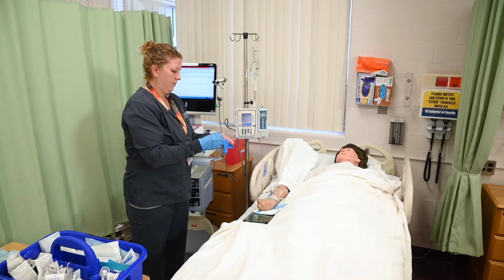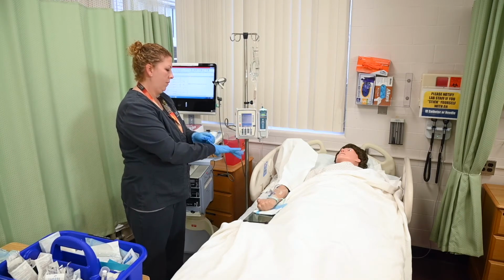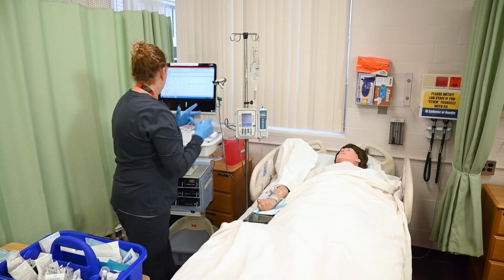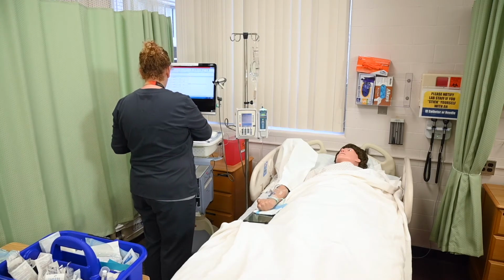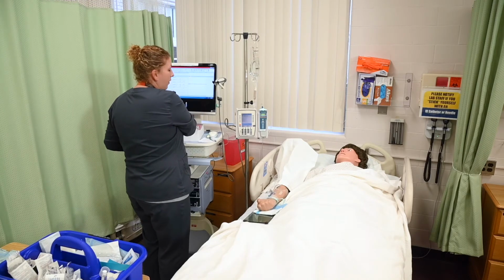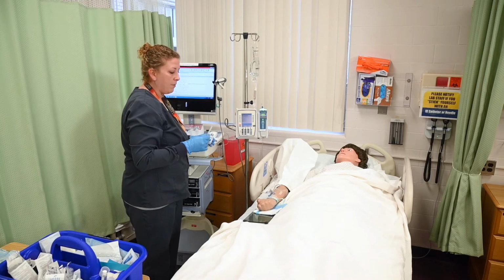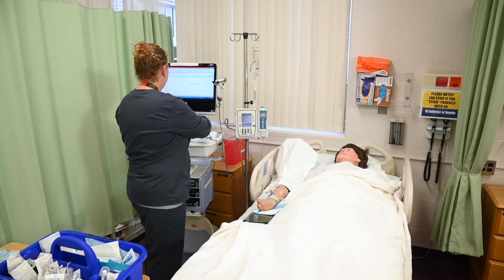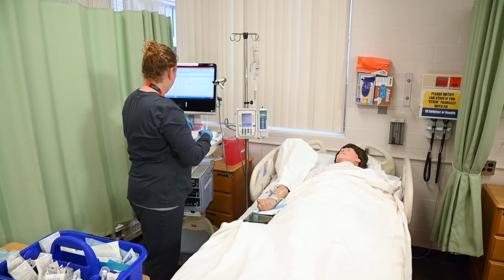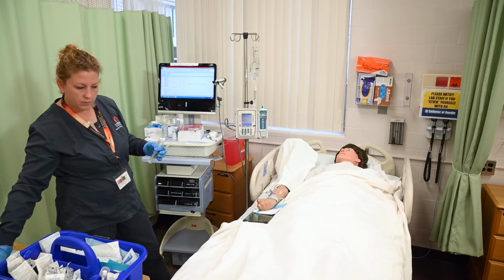Sarah is getting ready to do the IV push medication at this time, so she must confirm if it's compatible with the IV solution. For the purposes of this video, we're going to assume that our IV push medication is not compatible with our infusing IV solution. Okay, in that case, she has to stop infusion of the primary and clamp the line.